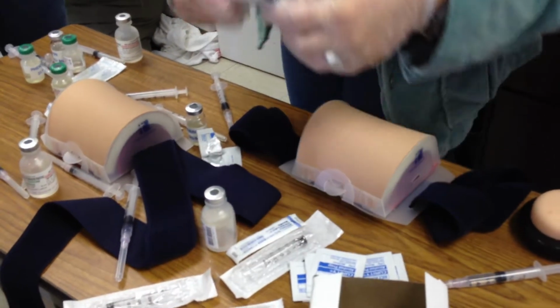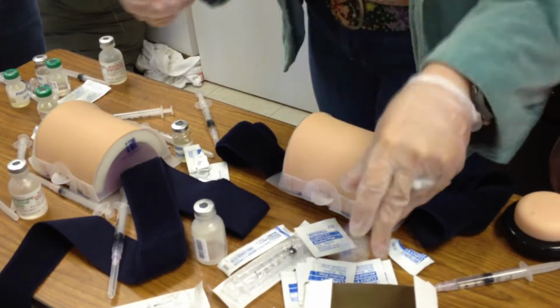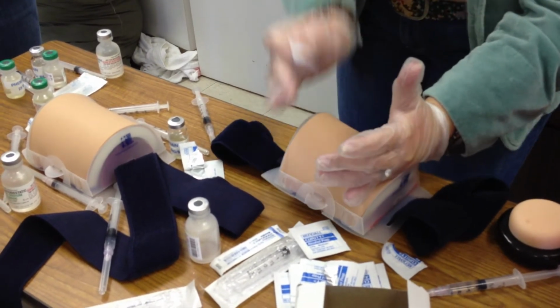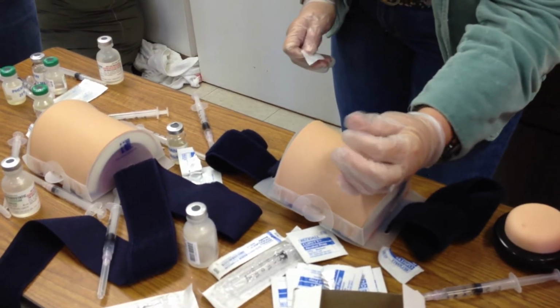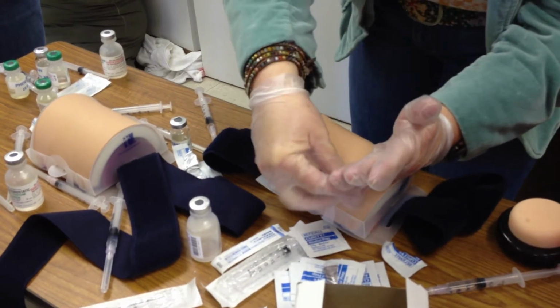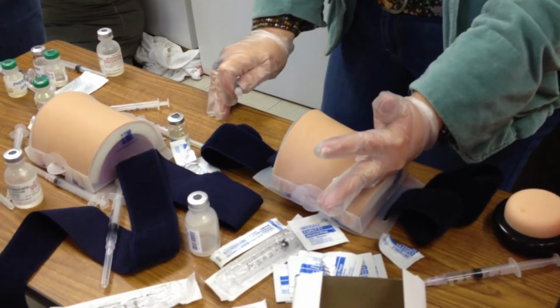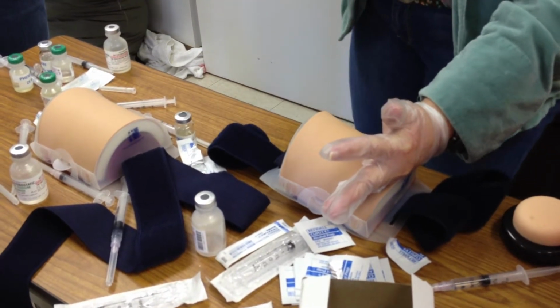All righty. Alcohol pad, just tear straight down the middle, and it's ready for you to grab. Okay, ready to go. Found my site, acromion process, couple of fingers down. Now I'm going to take my non-dominant hand, using the heel of my non-dominant hand, leaving my fingers free to help me, because this is my helper hand. Clean my site. Just kind of stick that there because I'm going to need it later. Grab my syringe. If I have a table close by, I will take my cap and place it back down on my table just to get it out of my way.